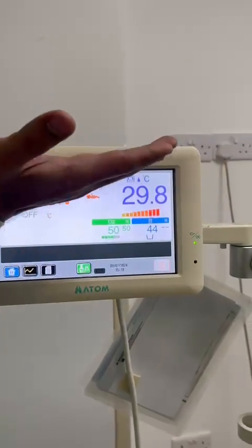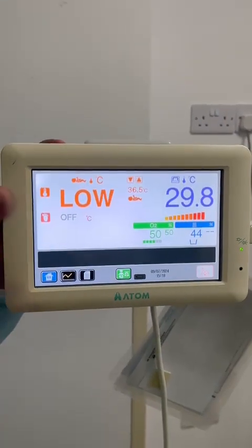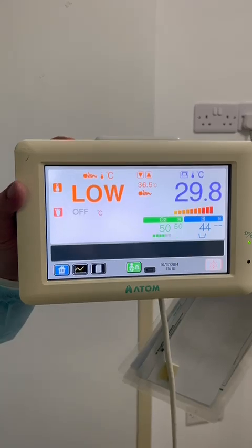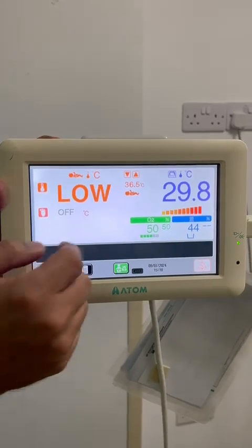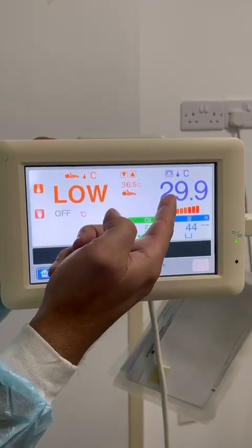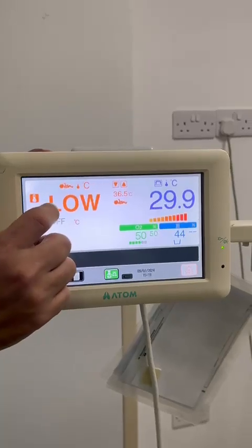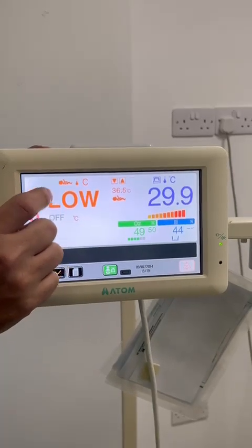The upper part of the display is related to temperature control. This one shows the incubator air temperature, and this one shows the baby temperature.